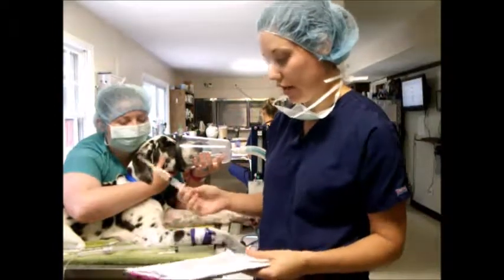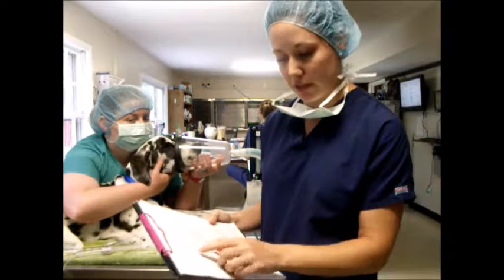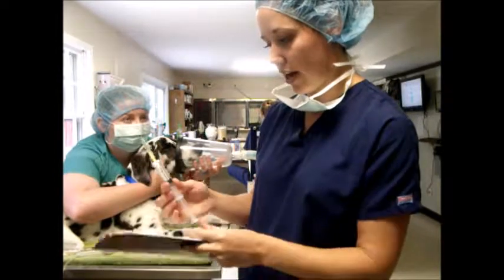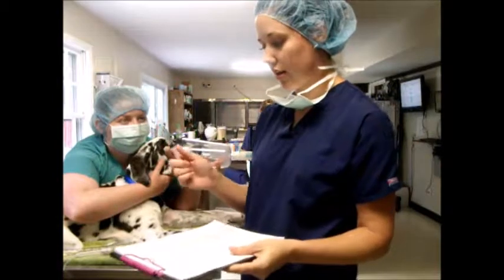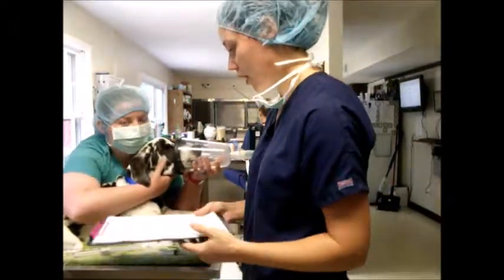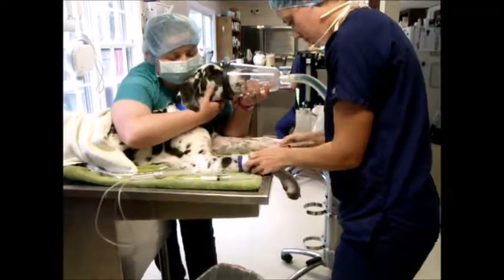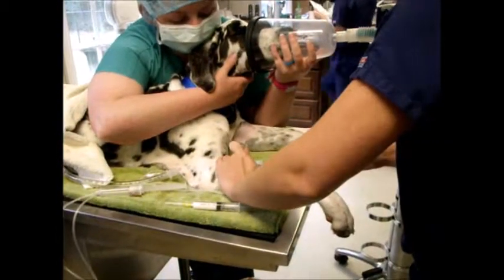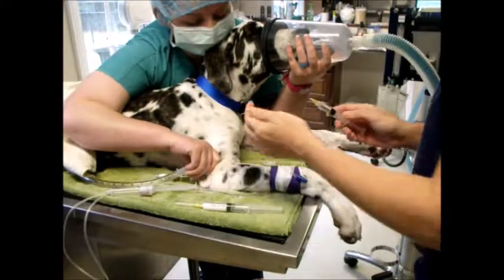I'm just going to double-check what we're using to induce this protocol. There's a dose of 3 mg per kg. I already did that calculation — that's 7.35. I'm going to verify that it's correct and make sure there's no air bubbles, which there aren't. I've got some heparinized saline, at a rate of 1 to 100 for flush. I'm going to go ahead and flush her real quick and make sure the catheter is clean with at least two mls.